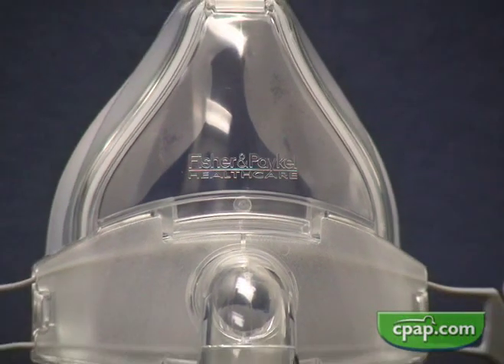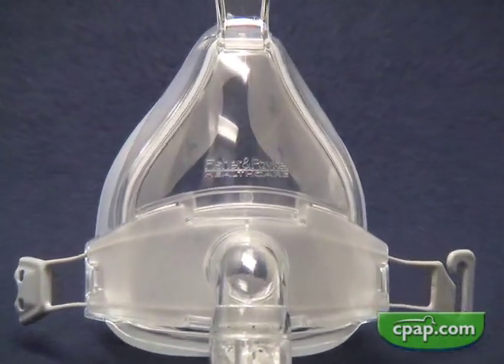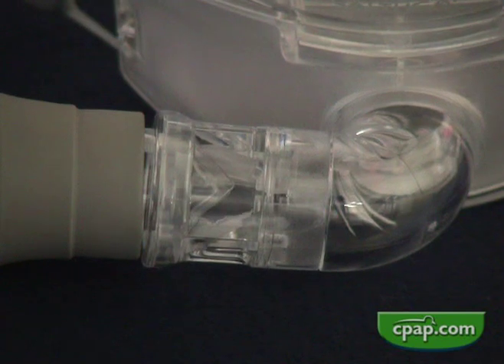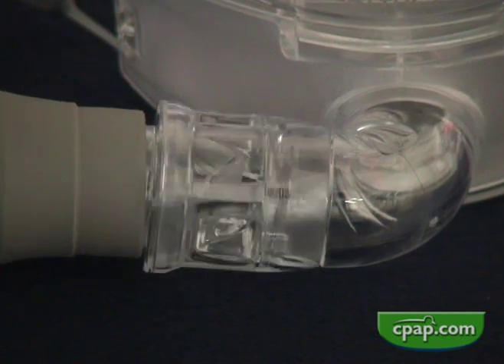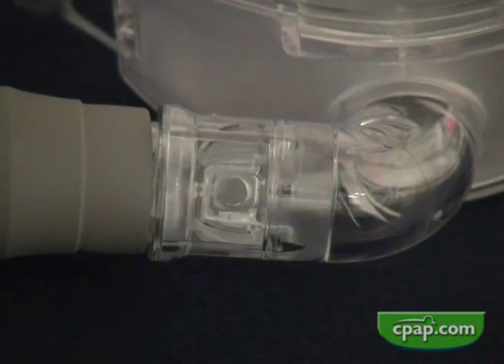The exhalation ports are quiet and do a good job of removing waste gas. Because full face masks cover the nose and mouth, a machine failure or power outage can cause excessive re-breathing. All full face masks use non-re-breathing valves that open if air flow from the machine ceases, providing an opening for breathing.